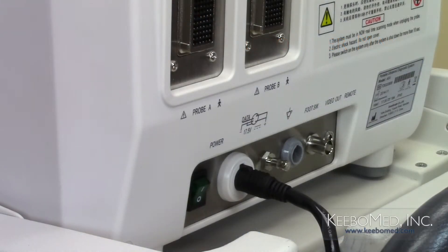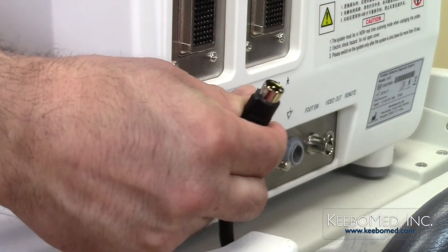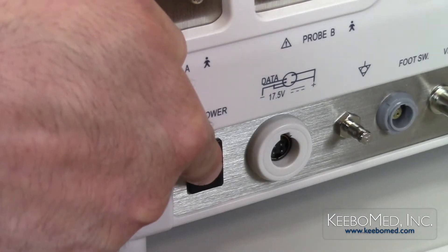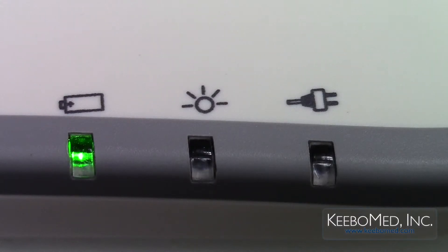To use the battery power on the A6, follow these steps. Step 1: Disconnect the output plug of the AC power adapter from the rear of the ultrasound. Step 2: Turn on the system by pressing the power button switch on the rear of the ultrasound. The battery power indicator light on the keyboard will now be illuminated.